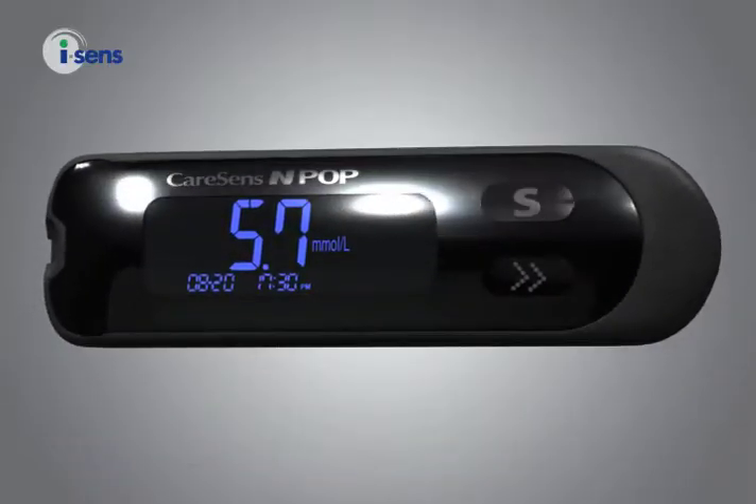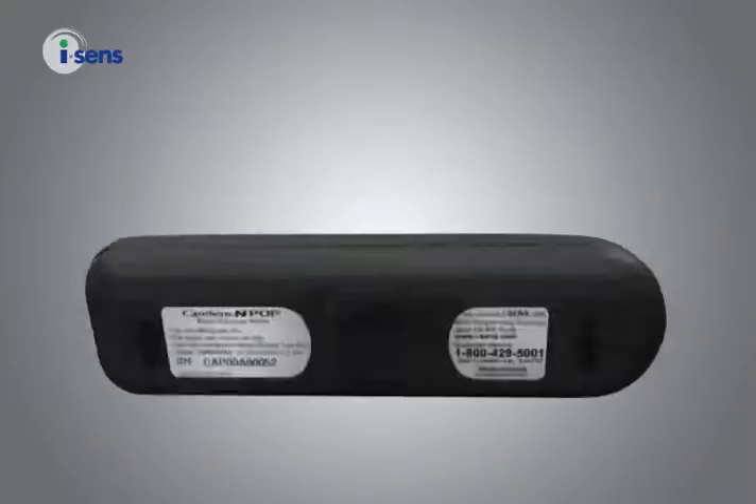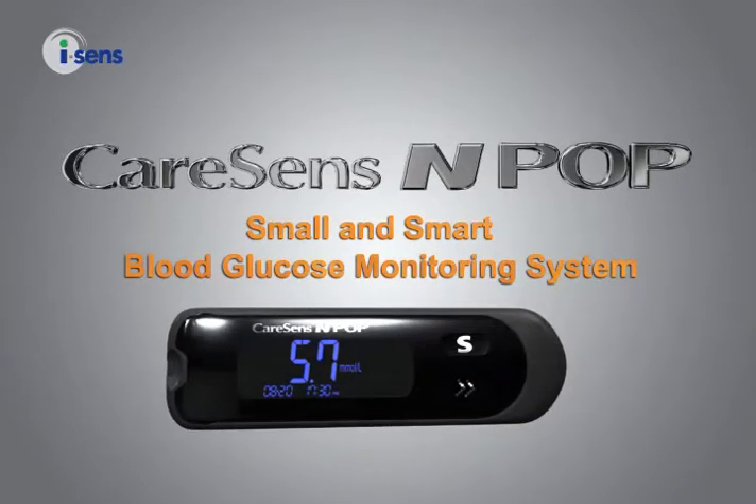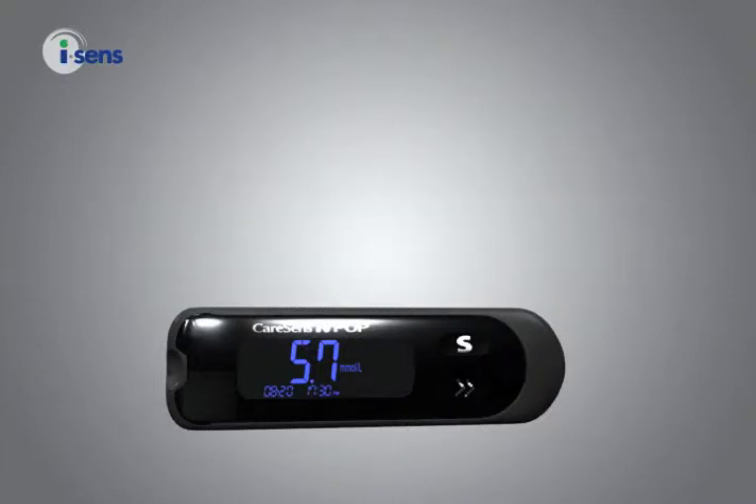CareSense NPOP, the smart, stylish, pocket-sized blood glucose meter. Meet and experience the advanced blood glucose meter with exciting new features.